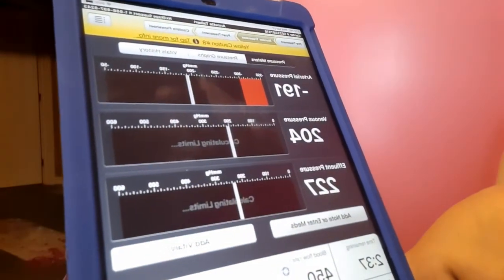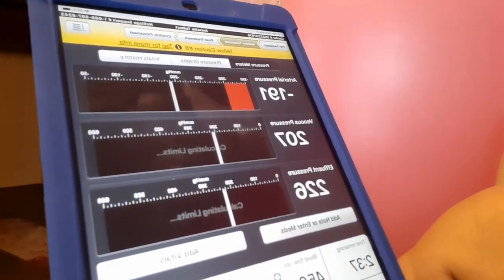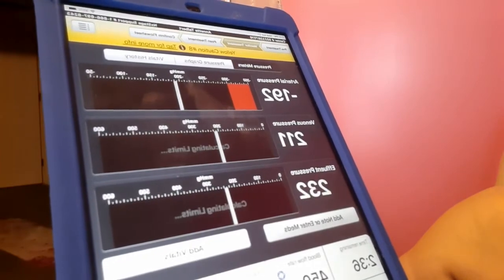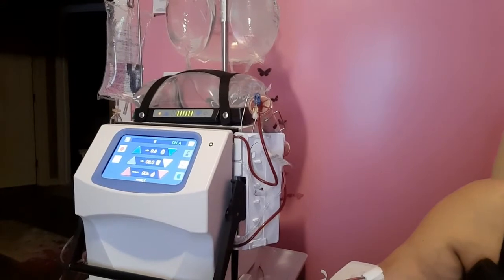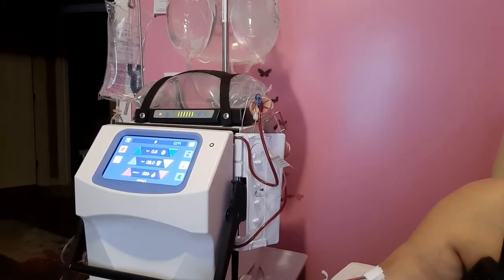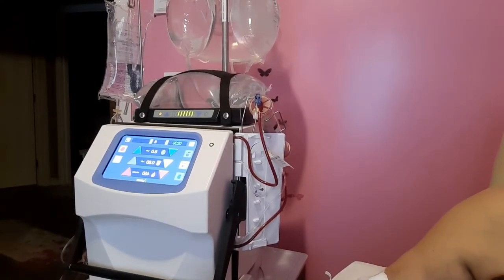450, and we're at target, and all is well. We're under 50% of 450. And that's it. So now I'm in treatment. Everything looks good. Numbers look great.